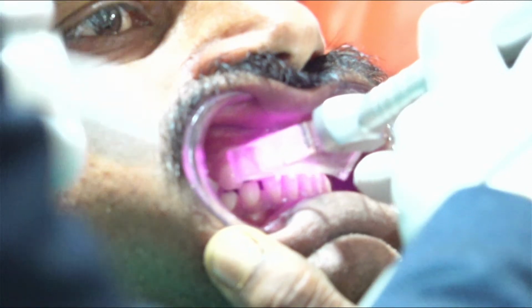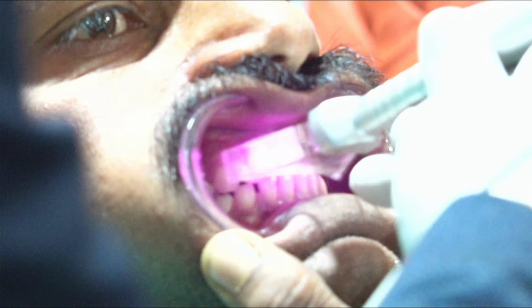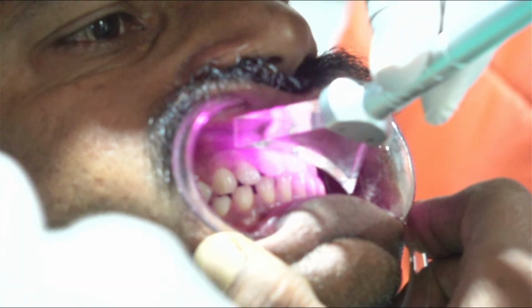So this again, you have to do 15 minutes. Got it? Let me do at least for 2 minutes. What happens, if I keep it for 15 minutes on only 2 teeth, next day the patient wakes up and sees that only the two teeth are white, he will come back.